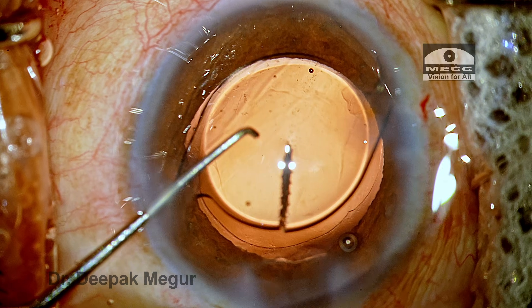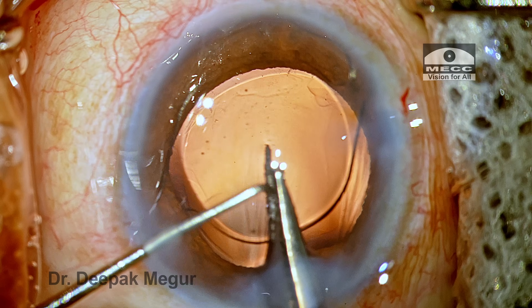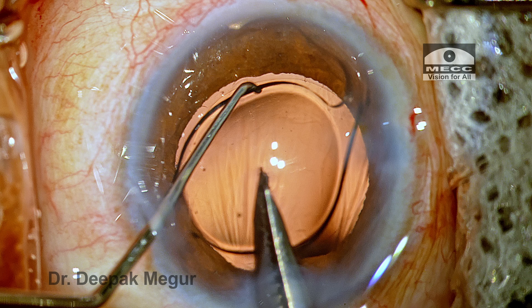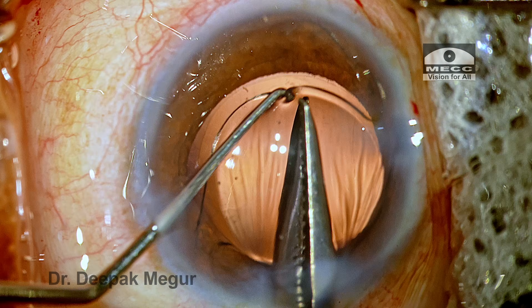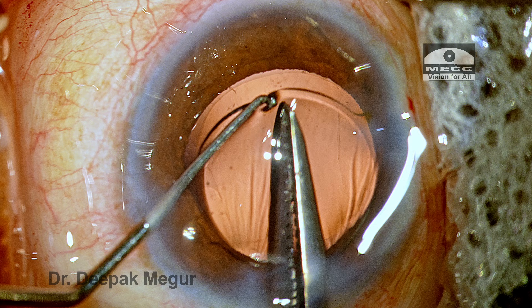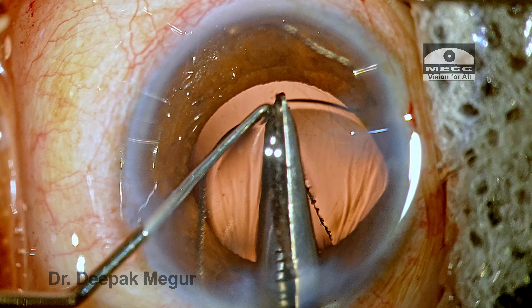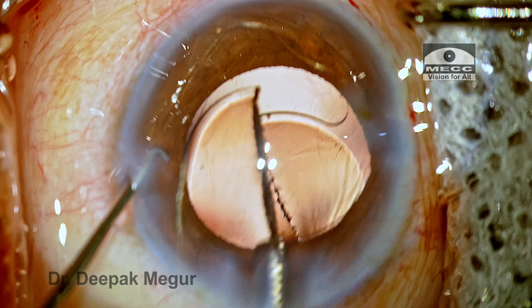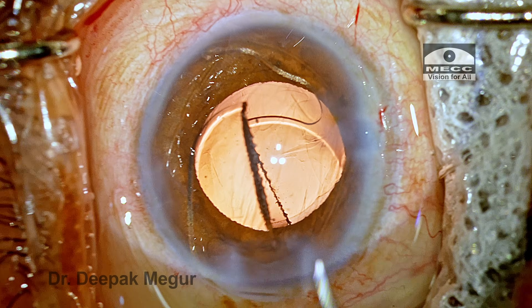Now we begin the lens cutting process. Observe the left hand — the Sinsky hook has gone in and hooked the lens. With the scissors, I traverse across the entire length of the lens, reaching the distal end, and then cut. The second instrument prevents the lens from jumping out. The lens is now cut into two full halves, and now is the time to pull them out individually.